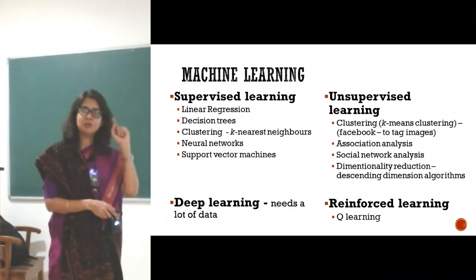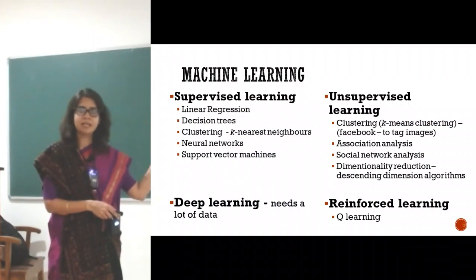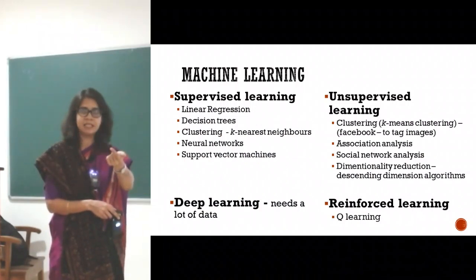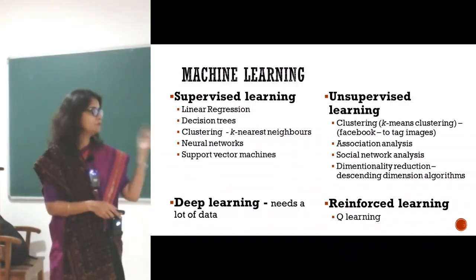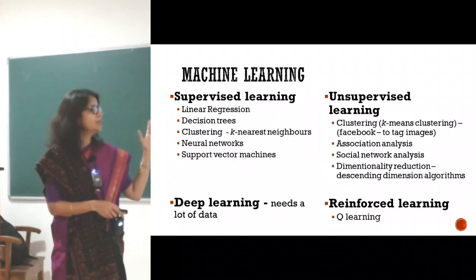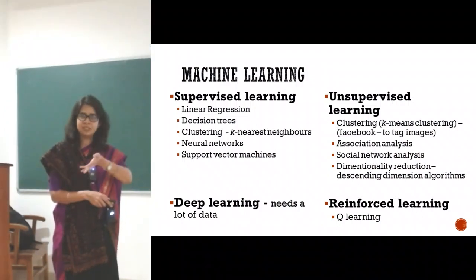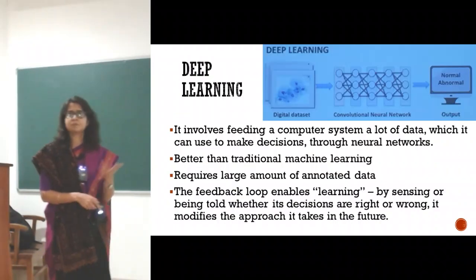And when you tag, you are giving reinforced feedback information back to that software. The image it has picked up from Facebook and is showing, you are correctly identifying as you, so you are giving a positive feedback loop. So it improves its algorithm based on that positive reinforcing feedback. These kinds of machine learning algorithms, whatever is being used in digital imaging computation, are being used in Google all the time. The same thing is being used in pathology to make diagnosis better.